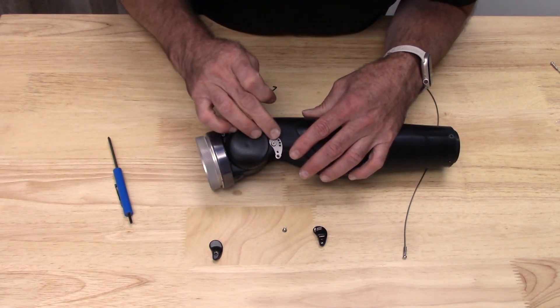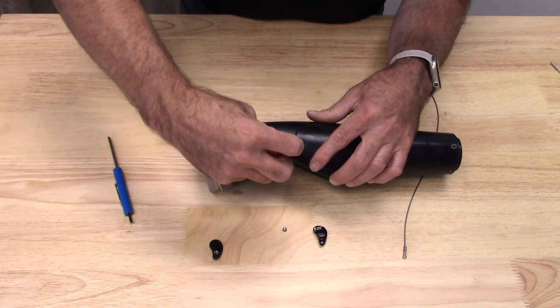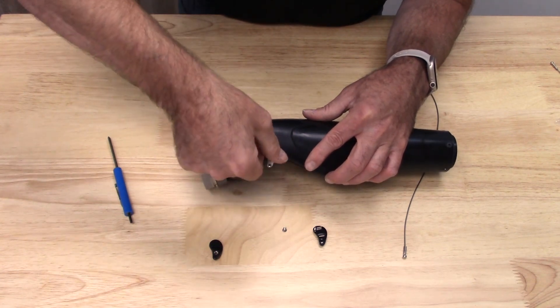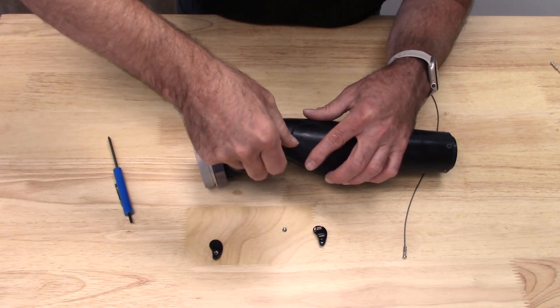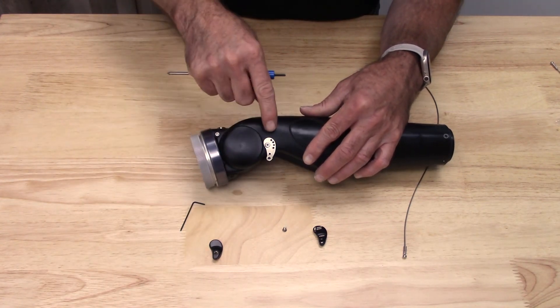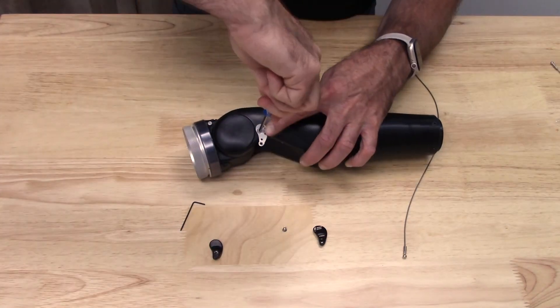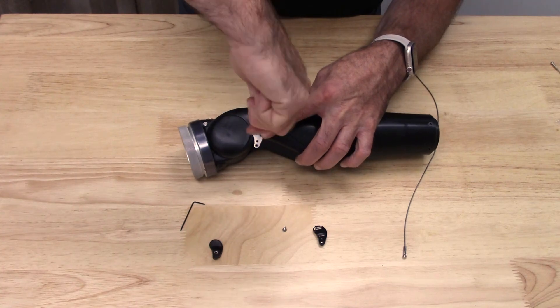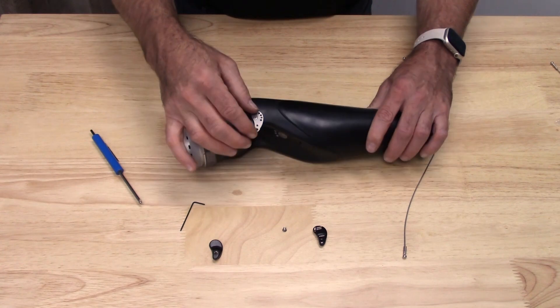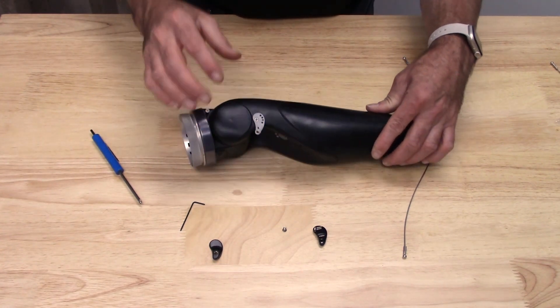Once I determine my angle, I'm going to go ahead and back that set screw out. The reason I'm doing that is so that lift tab doesn't move. I back that screw out just enough, and you can see where that should sit in the assembly. Once I'm done with that, I'm going to go ahead and tighten down that screw. Everything's there nice and flush in the right place.